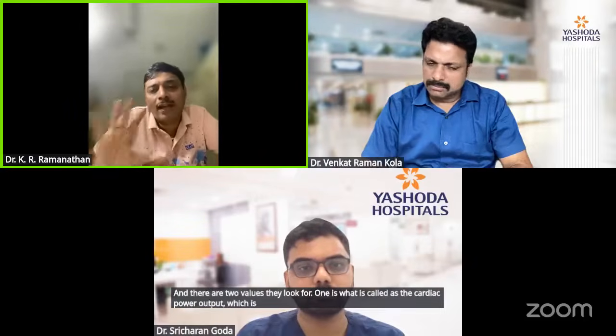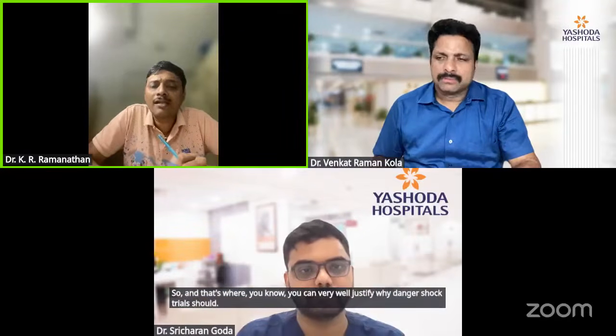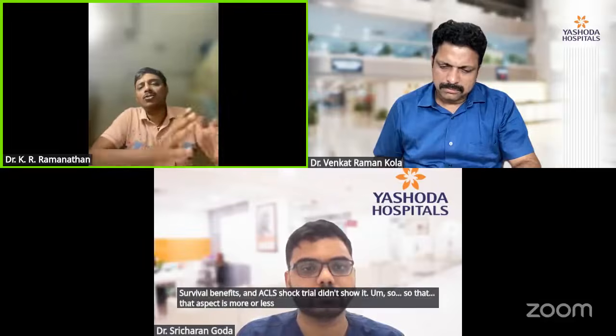And there are two values they look for. One is the cardiac power output, which is an indirect measure of LV function. The other is the pulmonary artery pulsatility index, or PAPI, which is a measure of right ventricular function. Based on which one is deranged, you choose your device appropriately. So with RV dysfunction, VA ECMO might work. If it's pure isolated LV dysfunction, Impella might be the best. And that's where you can justify why the DanGer Shock trial showed survival benefit and the ECLS-SHOCK trial didn't. So that aspect is more or less clear as to the choice of MCS device.